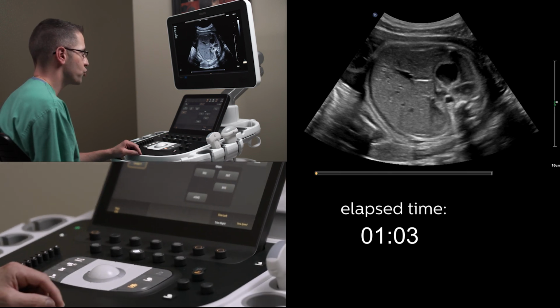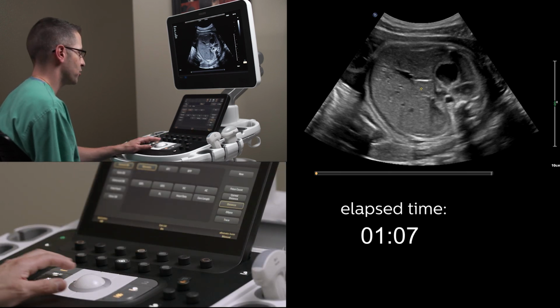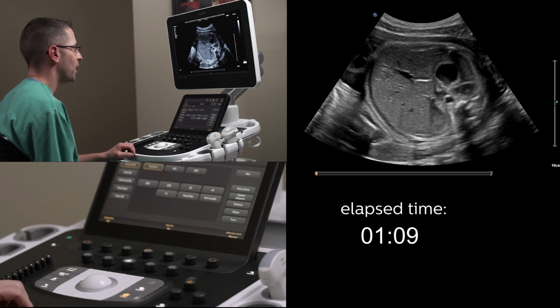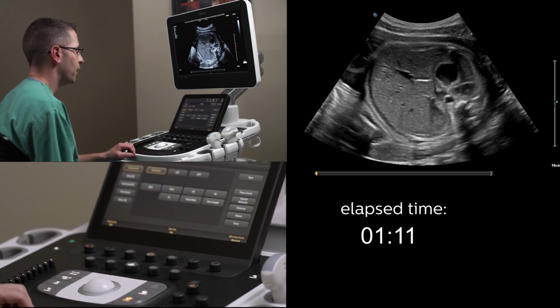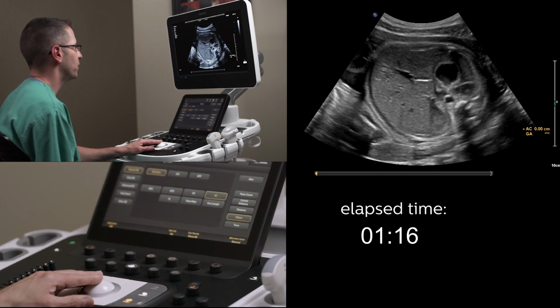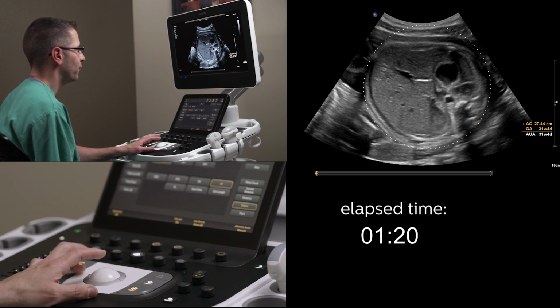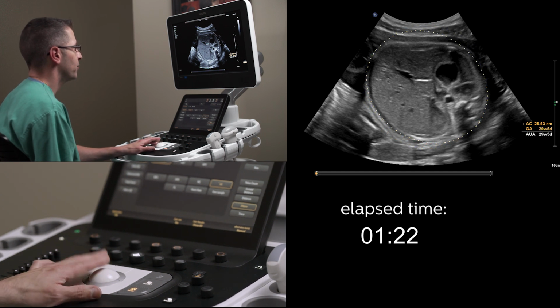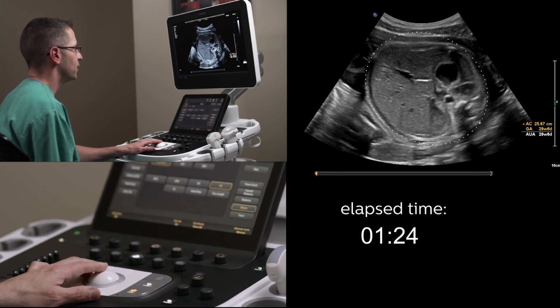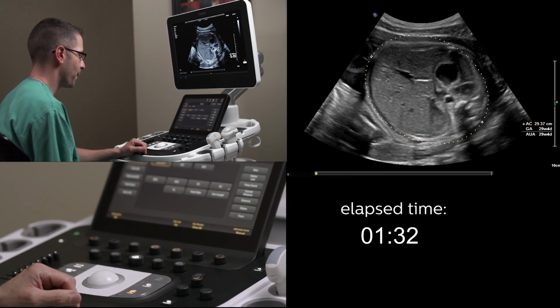So next we're going to measure the abdominal circumference, and I'll show you how that works in a manual fashion. So we have our abdominal circumference, and I'm going to select abdominal circumference, and now I need to measure it. We place the caliper at the front of the abdomen, we place the caliper at the back of the abdomen, we make the size of the ellipse slightly smaller to work around the belly, and you can see this requires sometimes a bit of manipulation, and we finally accept that.